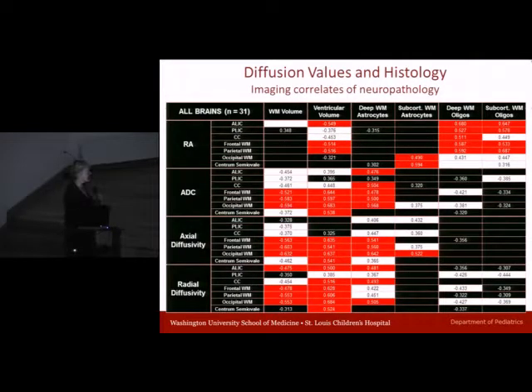In contrast, and this is very busy and it's just meant to give you a concept, these are measures on diffusion-weighted imaging. So as you know, diffusion-weighted imaging looks at the movement of water, and from that we can measure how far the water moves by a thing called the apparent diffusion coefficient, or we can look at the orientation of the water movement called relative anisotropy.